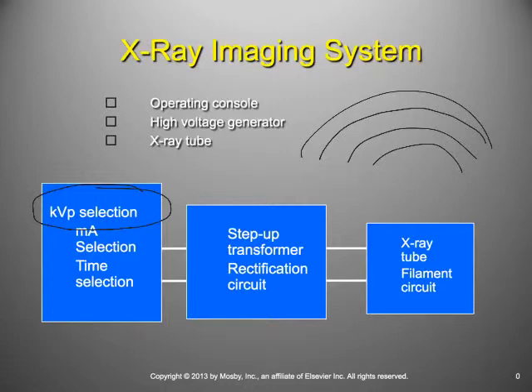So I can tell it the maximum amount that I want it to give. That's why I have a kVp, a kilovolt peak. But it's going to give me spectrums of energy all below that. It's going to give me everything up to that. It can't go higher than that when I turn on the X-ray tube, but it'll give me a spectrum of energies, hopefully at least reaching that kilovolt peak, right?